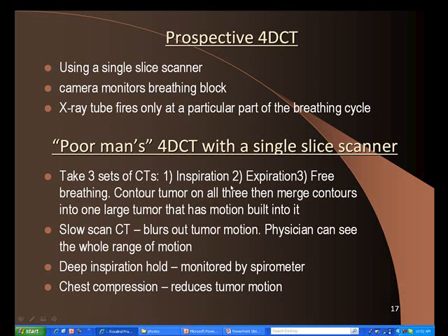There's also going to be more dose. The patient's going to get a lot more dose with retrospective. Okay, so more computer memory required, computer memory that is, and delivers more dose to the patient. Patient dose, which is bad.